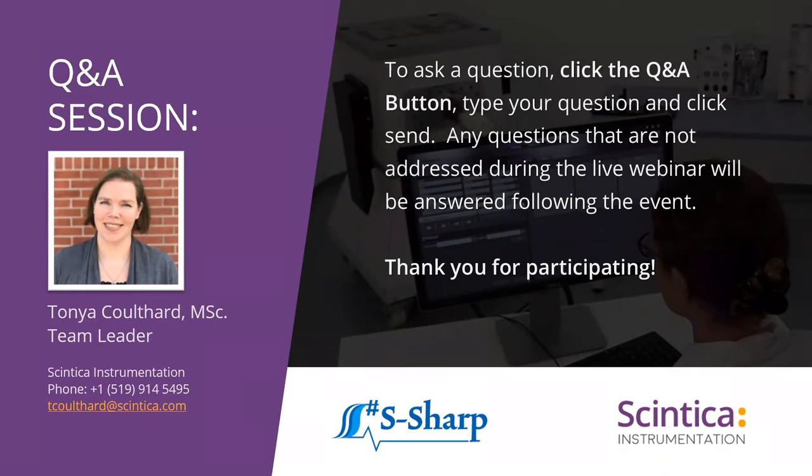Okay, perfect. You also mentioned different data formats during your presentation briefly, but can you just elaborate on what data formats can be exported from the system?